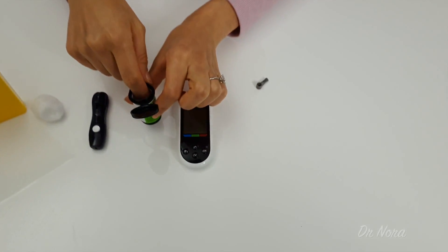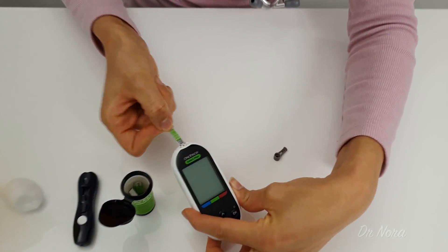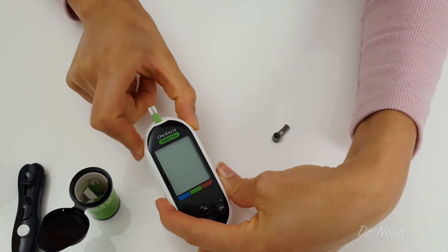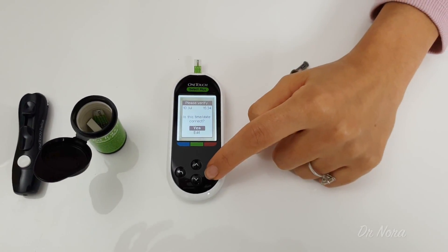First up, it's time to turn on your machine. You can do this by placing a testing strip into the machine like so. Make sure that you've set the date.